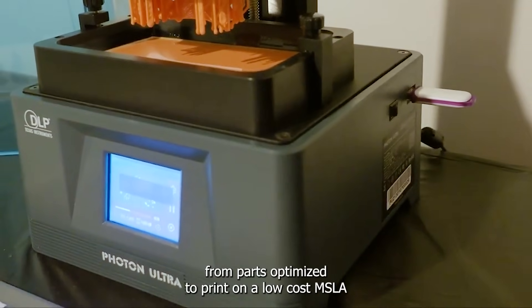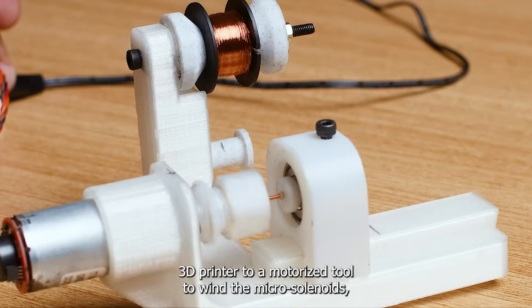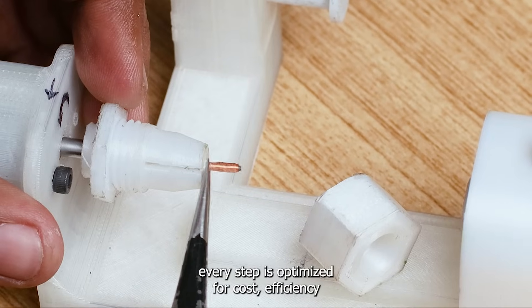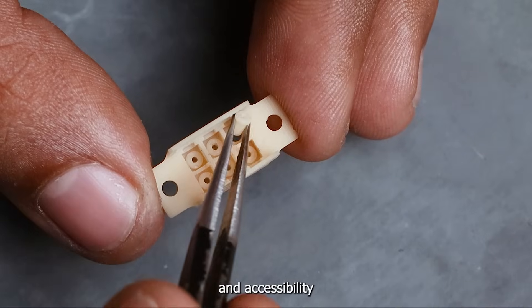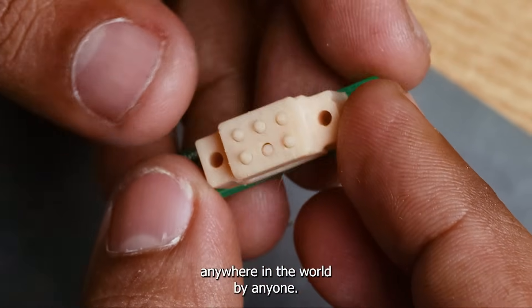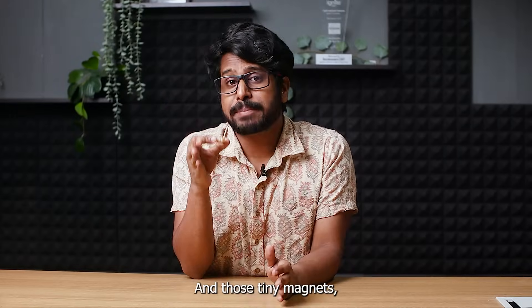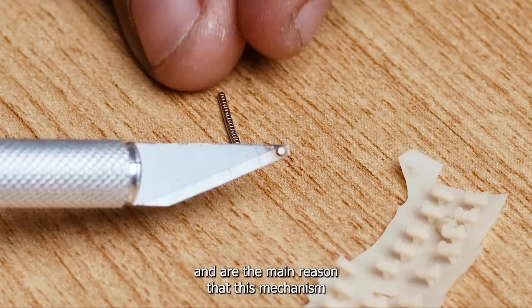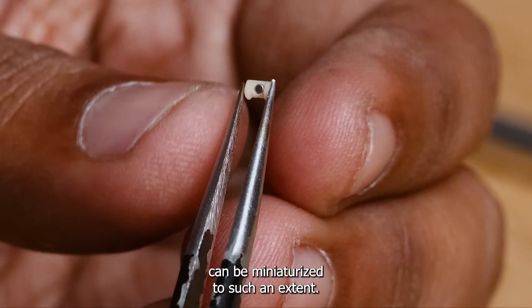From parts optimized to print on a low-cost MSLA 3D printer to a motorized tool to wind the micro solenoids, every step is optimized for cost, efficiency and accessibility so that the braille cells can be manufactured anywhere in the world by anyone. And those tiny magnets — they are the heroes making this project possible and are the main reason this mechanism can be miniaturized to such an extent. The best part is that they are easily available.